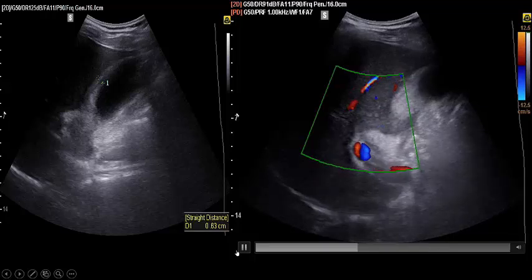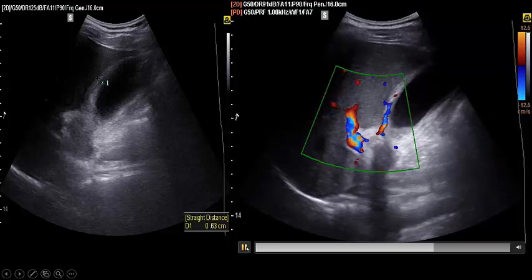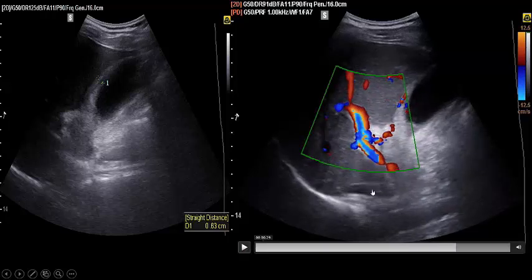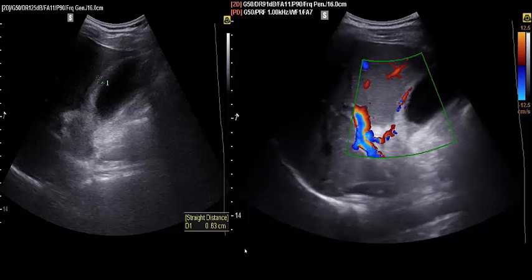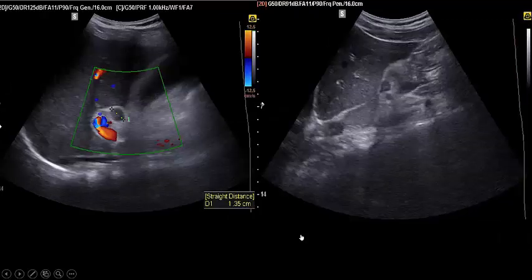And when I fire the color, as you see, we found very vascular and inflamed gallbladder wall, and very vascular area, inflamed area, very apparent. You see hyperechoic mesentery denoting acute inflammation. Moreover, I find lymph nodes appear very clear in the porta hepatis, denoting inflammation, the infection. You see distended gallbladder wall, vascular, inflamed area with prominent fat strand, hyperechoic mesentery, all these going with inflammation.